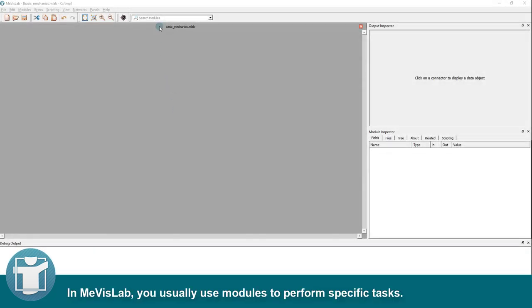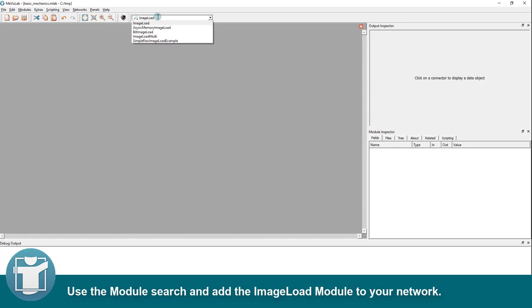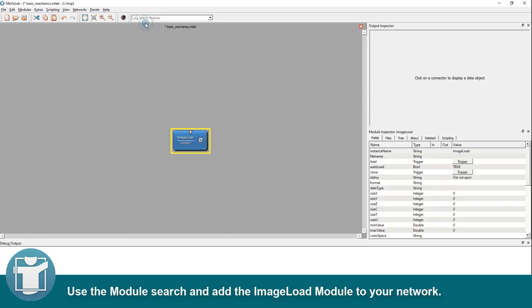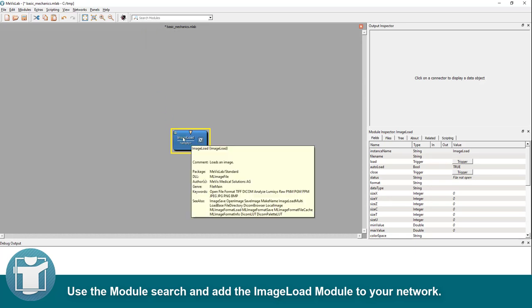In Mevislab, you usually use modules to perform specific tasks. Use the module search and add the image load module to your network.